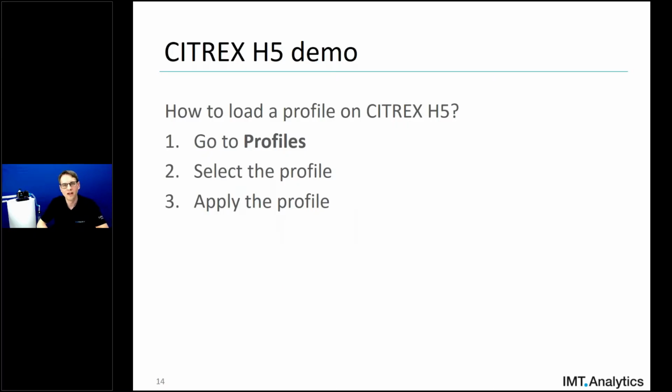And also, we have discussed how to load them. We just go to the profile section, select the profile we want to use, and then just load it and apply it to the device. So let's have a look how I can do this on CITREX H4, because this is completely different.